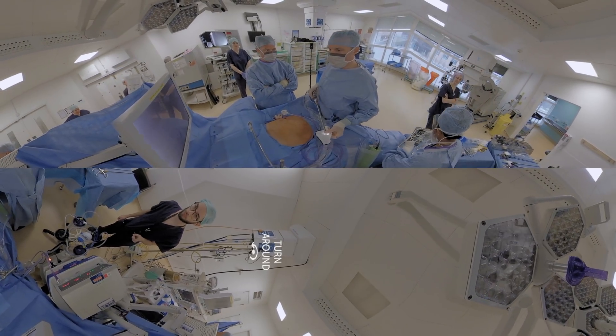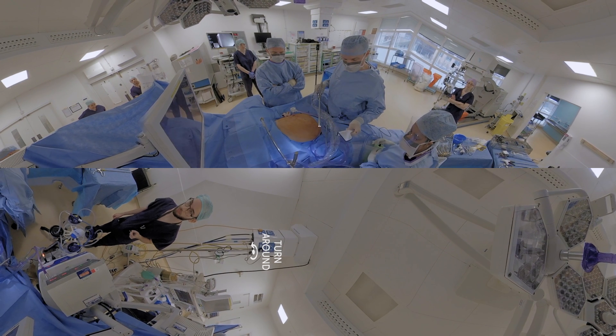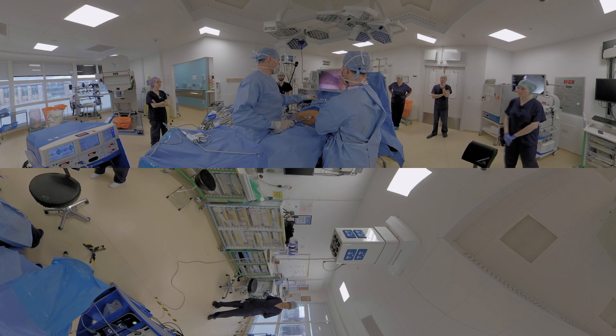We're embarking on an operation called an Ivor Lewis esophagectomy — that's an operation to remove cancer of the esophagus. We start in the abdomen, we dissect out the cancer, we turn the stomach into a tube, and in the second half we bring that tube up into the chest and join it from the stomach tube onto the remnant esophagus.